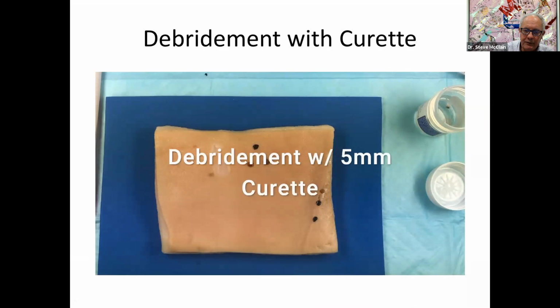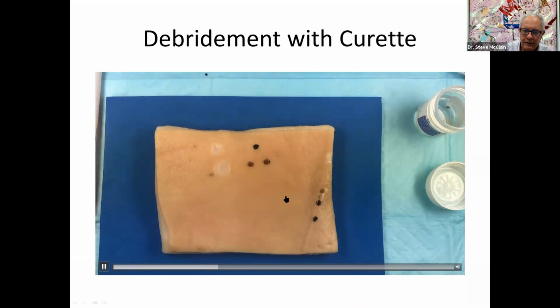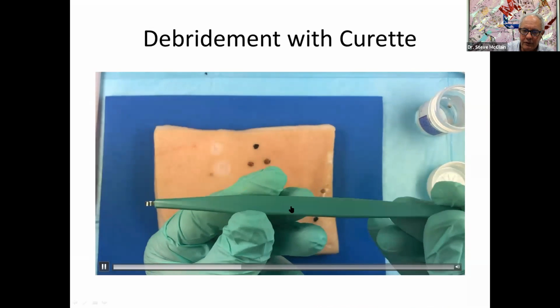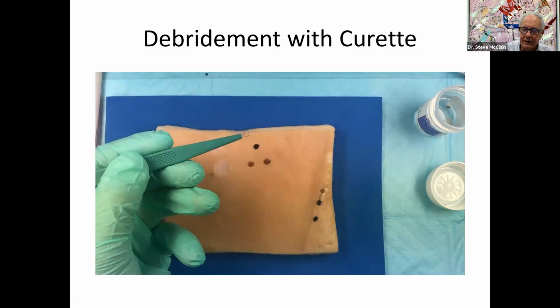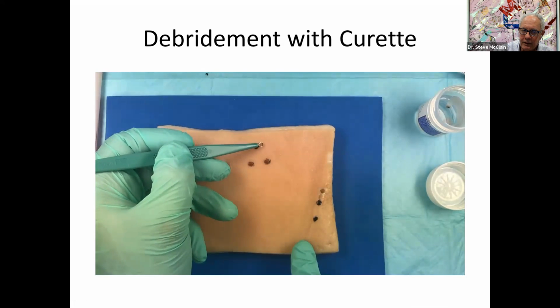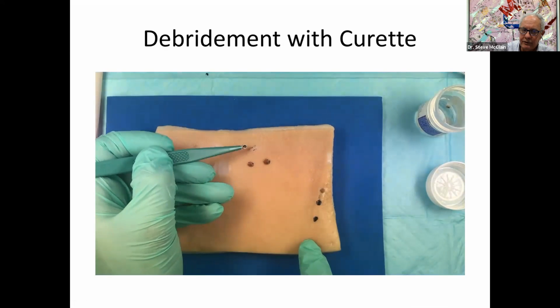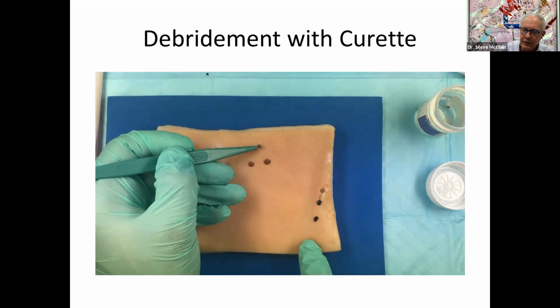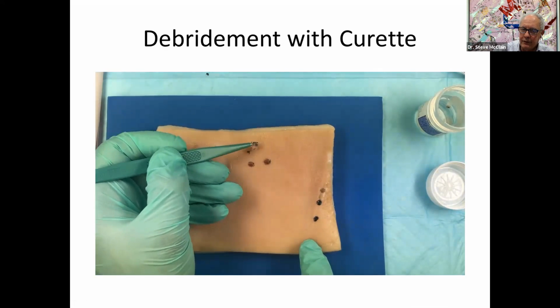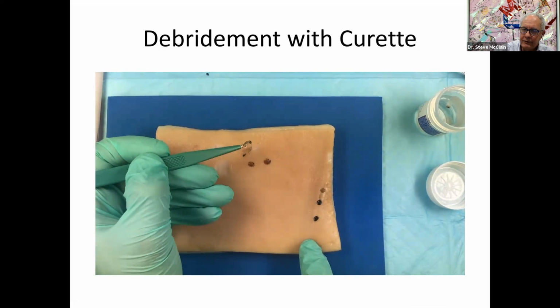Now notice when he opens this, you'll see the cross hatching. I think he should be showing it. There it is. This is the cross hatching. That's the dull side. So you can control the dull side, you can feel it. He's using his thumb to control it. And these also cut by slicing, but you're really going to scrape away the lesion. In the case of a wound, you scrape away all the dead tissue. You cut it away until you feel the hard dermis, the scrapey, scratchy kind of dermis. And then this gets dropped down into the formalin.